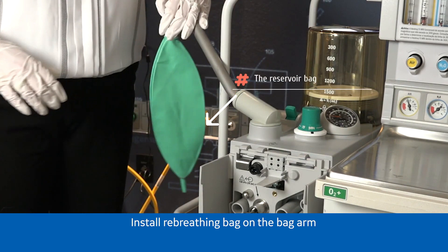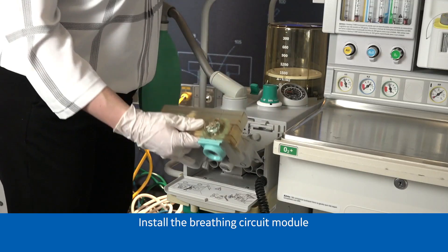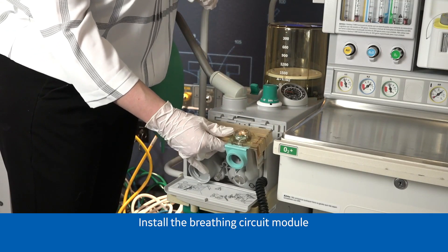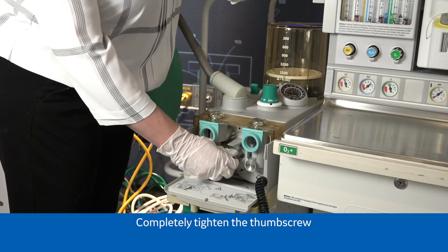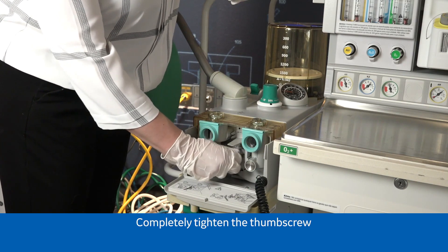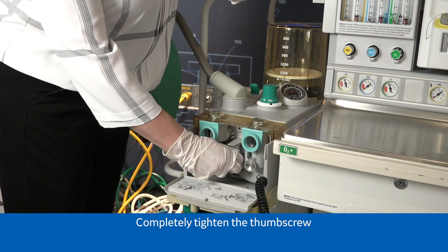In addition, it allows the anesthetist to monitor the breathing pattern of a spontaneously breathing patient. These are usually plastic or rubber, and can come in sizes between 0.5 liters to 6 liters. However, the most common size in the adult system is 2 liters.